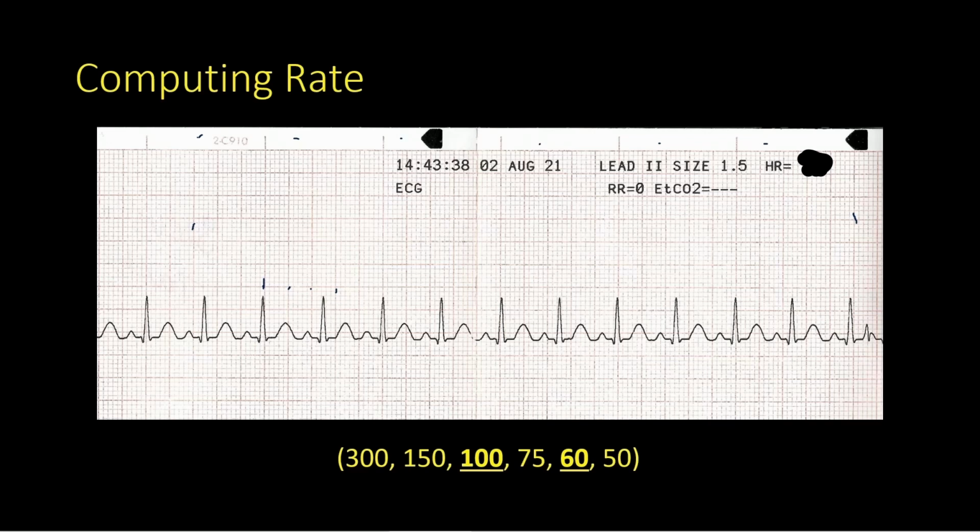If we look a little further down the strip and we say, I want to confirm that, so I'm going to say this is my starting point, and I'm going to again do a 300, 150, 100. Well, let's see, it's between 100 and 150, about halfway. So again, it's around 120 beats a minute. That's what we come up with, two different methods, and when we look at the actual strip, 120 beats a minute. So determining the rate, there's a couple of ways you can do it depending on how much strip you have, how much time you have, and how regular the rhythm is in and of itself.